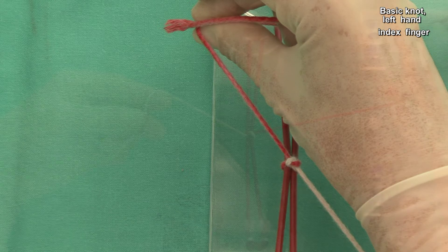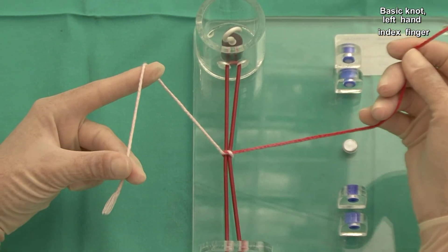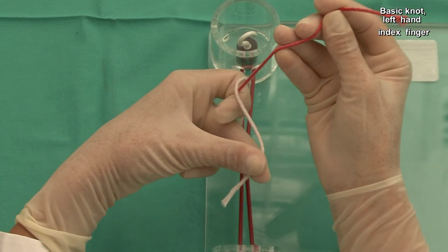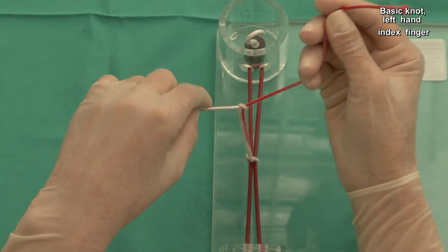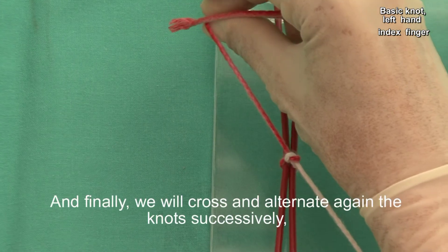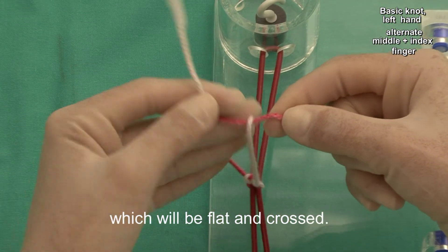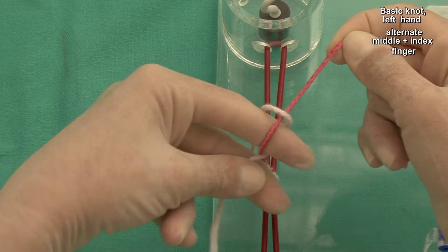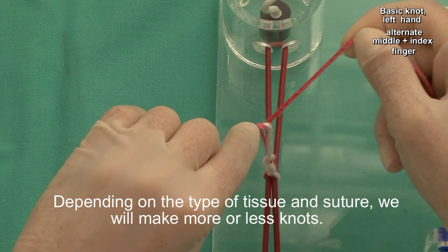Let's see it again. And finally, we will cross and alternate the knots successively, which will be flat and crossed. Depending on the type of tissue, we will make more or less knots.